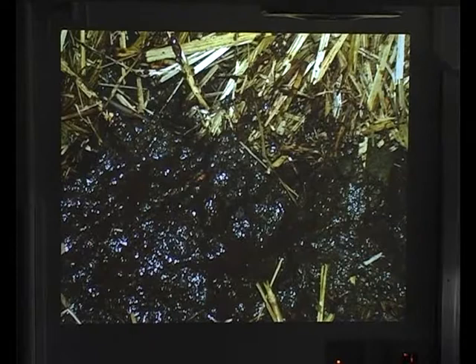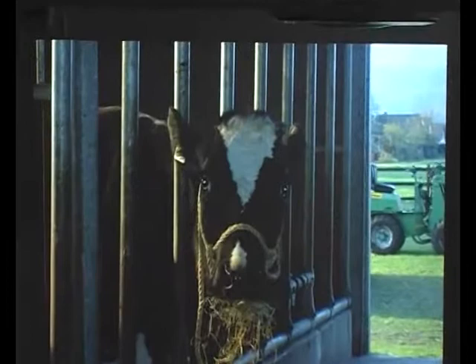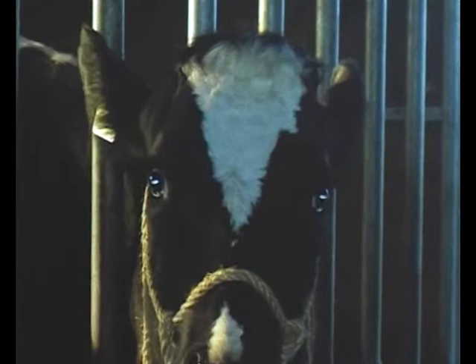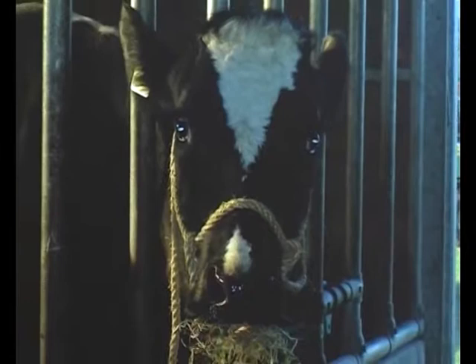This is my colleague with claw trimming. Mostly a few hours after the first surgery we have normal feces, and we can see that the cow begins with feed intake. Often we have a normal feed intake 4 or 5 hours after the first laparoscopy, and this is a sign that the abomasum is in the correct position. But we wait 12 hours and then do the second surgery and fix it. Perhaps it's not necessary to fix the abomasum, but we always lay the cow down a second time and fix the abomasum.